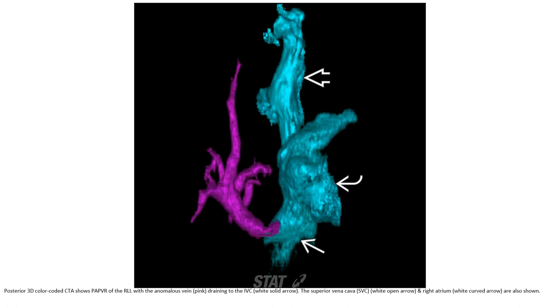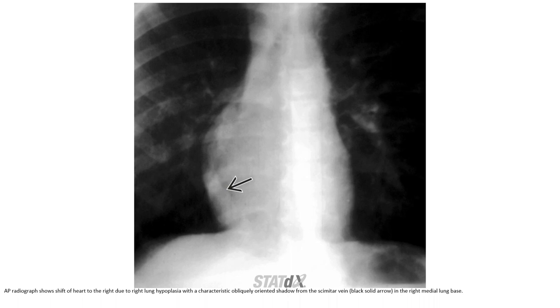MRA shows partial anomalous pulmonary venous return of the right lower lung with anomalous venous drainage to the IVC. The superior vena cava and right atrium are also seen. AP radiographs show mediastinal shift to the right due to right lung hypoplasia, with a characteristic obliquely oriented shadow from the scimitar vein in the right lower lung field.